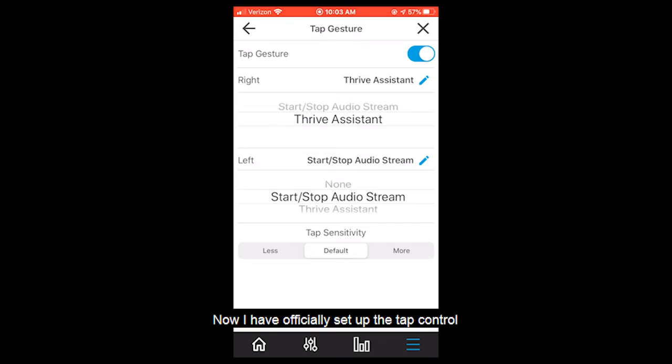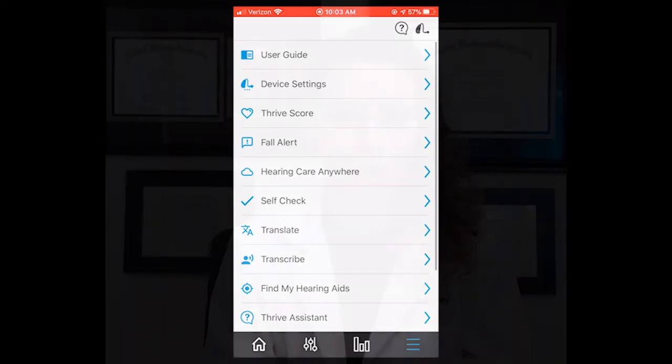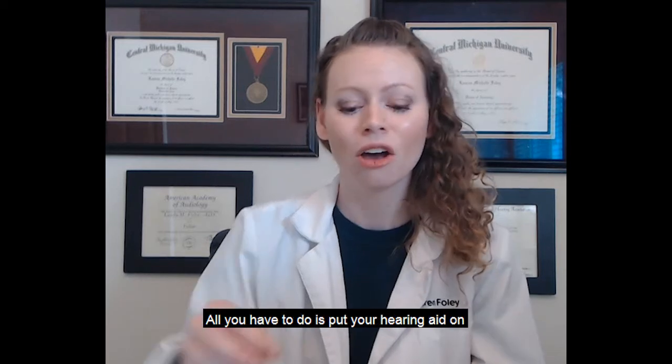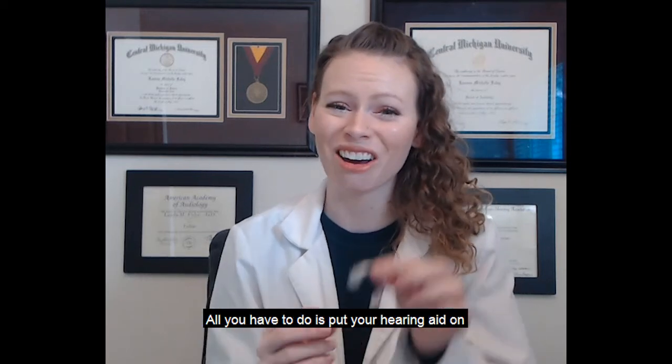Now I've officially set up the tap control for my artificial intelligence hearing aids and I can hit the X in the upper right hand corner to close out. Once you've specified how you want the double tap to be utilized, all you have to do is put your hearing aid on.